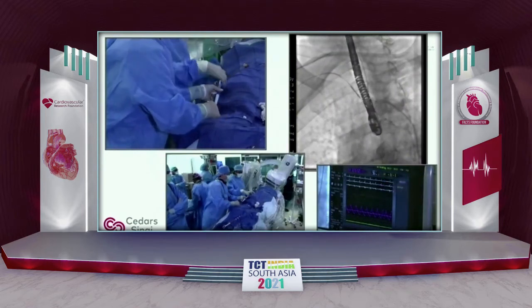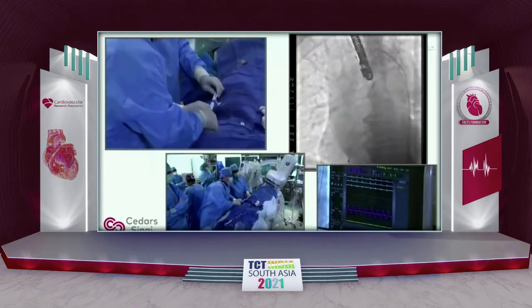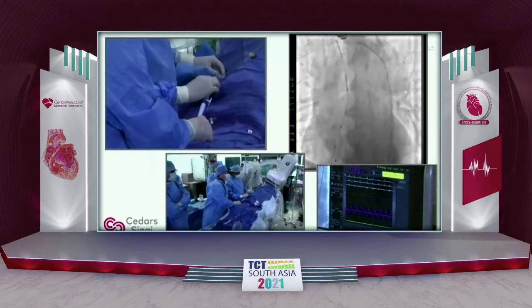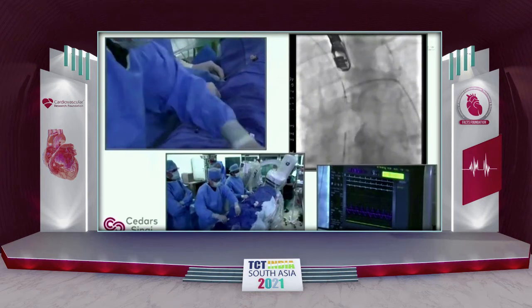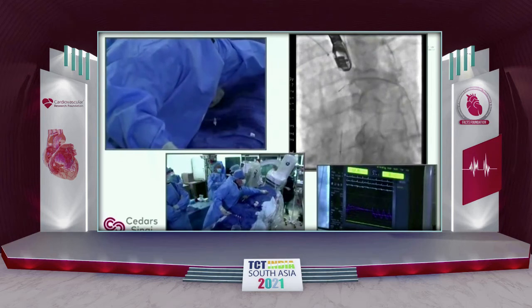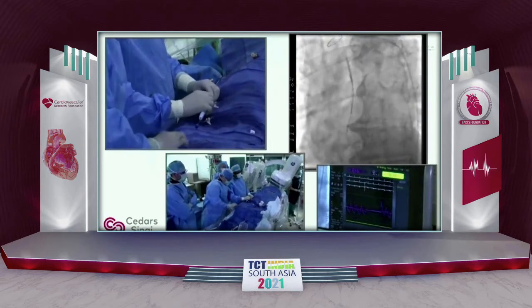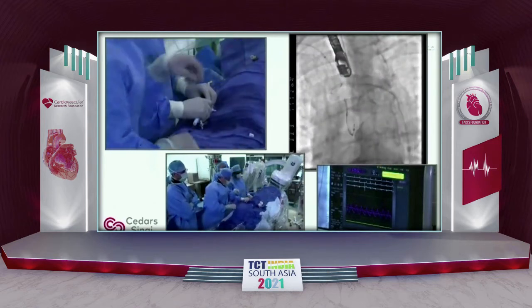But I think that for bicuspids, for example, I would always favor the use of TEE, because we want to make sure that we are not missing leaks. A lot of these patients are young, with heavily calcified valves and LVOT with a lot of calcium. Some of those cases are very low EF, and there are times when you end up doing patients with low EF and you want to have a lot of control. So I think that's another place I would tend to do it.